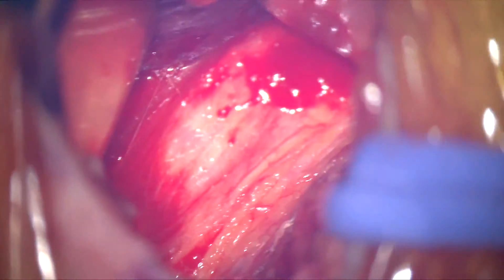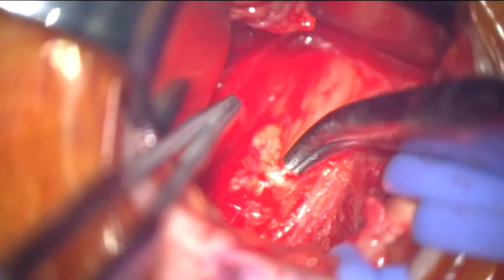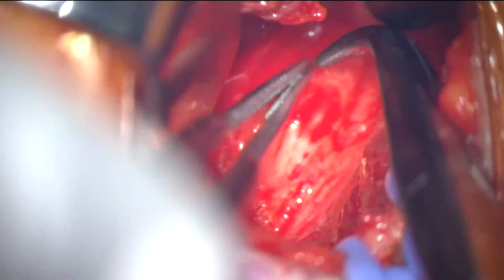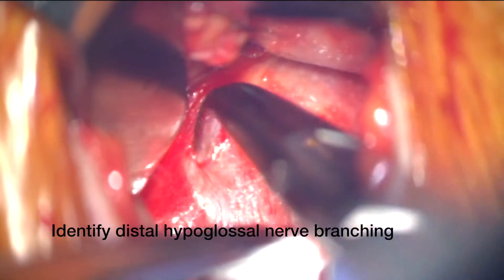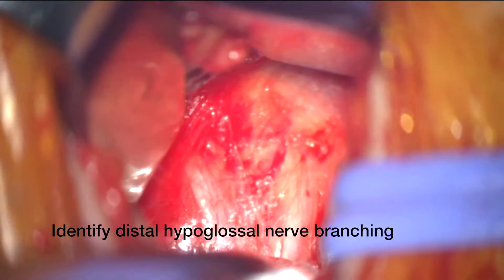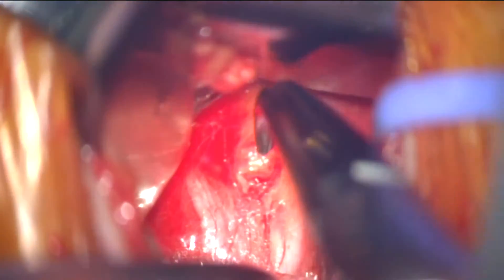What we've done is we've identified the hypoglossal nerve and we start using a variety of instruments to uncover the nerve from its covering fascia. About 70% of the time we identify and have to deal with a ranine vein, and that's pretty straightforward by ligating the vein. Now what we do is identify the hypoglossal nerve branches — the branch heading superiorly is the hyoglossus and styloglossus branches, and the branch heading anteriorly is the one we want to stimulate for the genioglossus muscle.